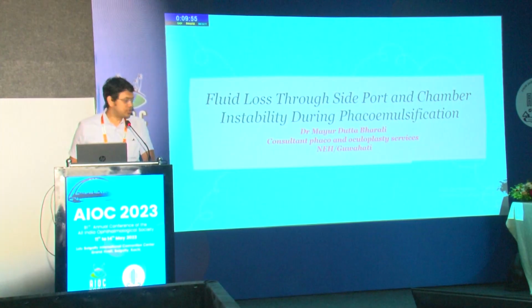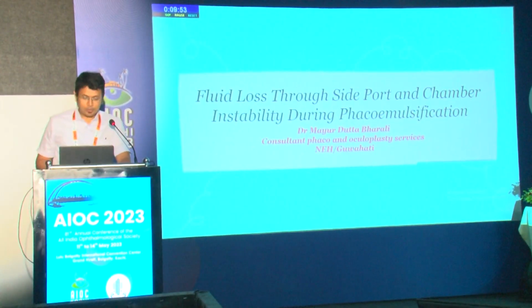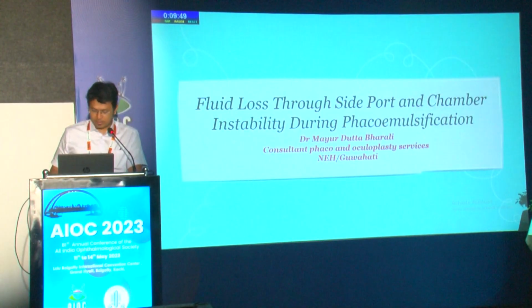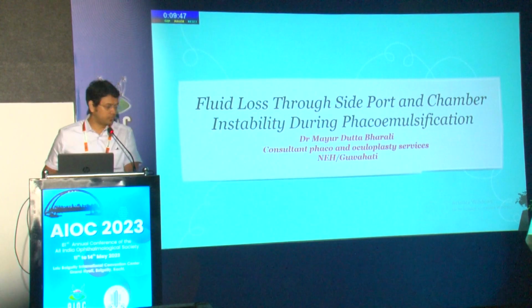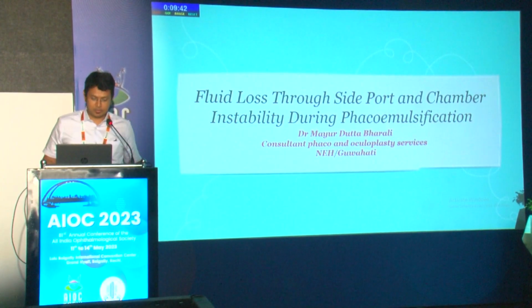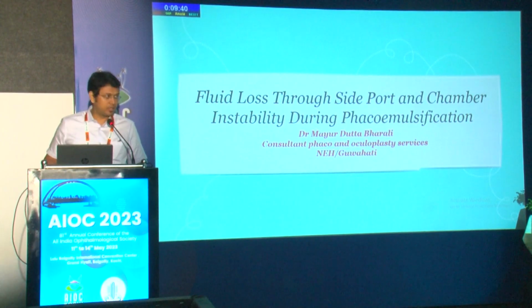So thank you, Dr. Jayashree, for giving me this opportunity. Today I'll be talking on fluid loss through side port and making the chamber unstable. This is normally overlooked in the whole of fluidics, thinking about vacuum pressure, infusion pressure, and all those things. But there is one thing which occurs normally: there is a fluid loss through the side port.